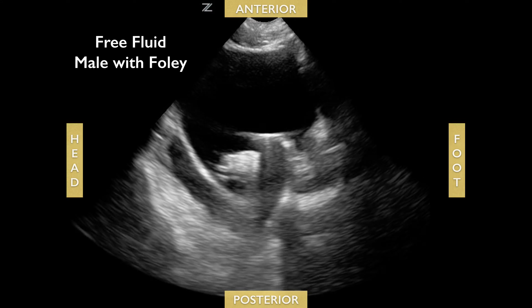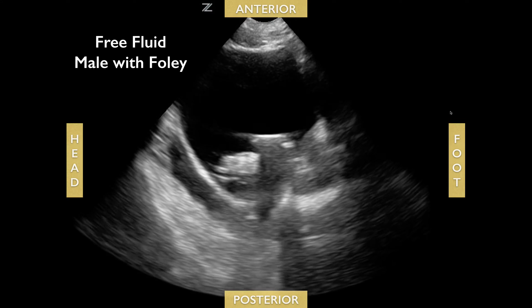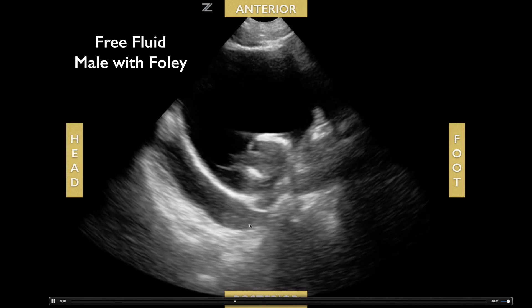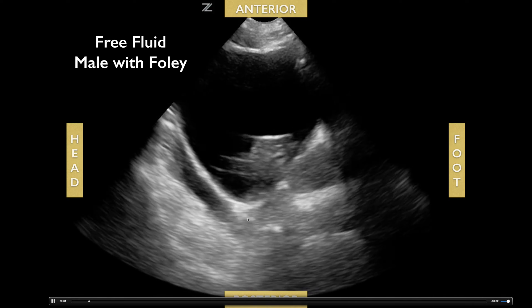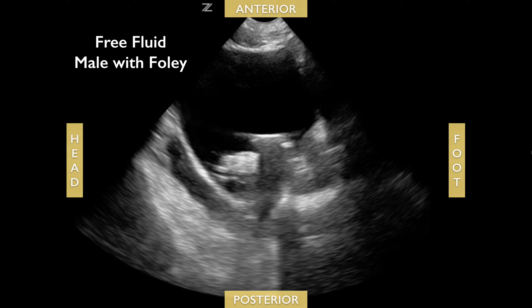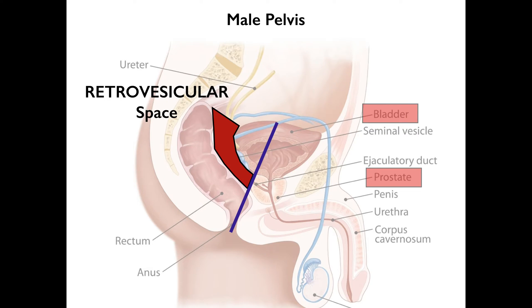Here's a patient with a Foley placed and you can see free fluid just posterior to the bladder. To recap, remember to locate the prostate and look posterior to that prostate and bladder in the retrovesicular space.